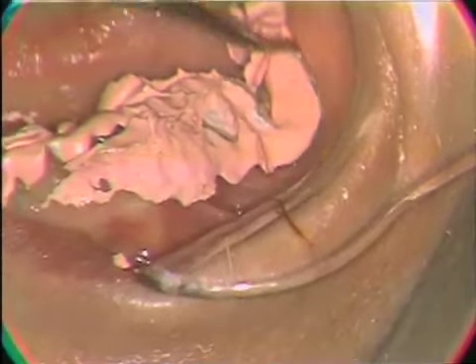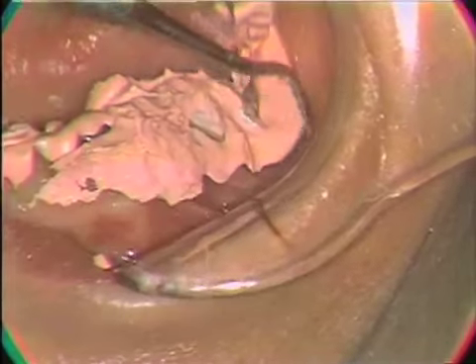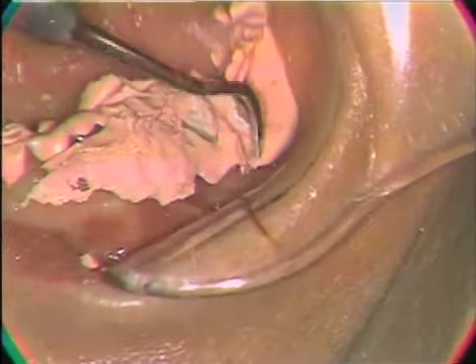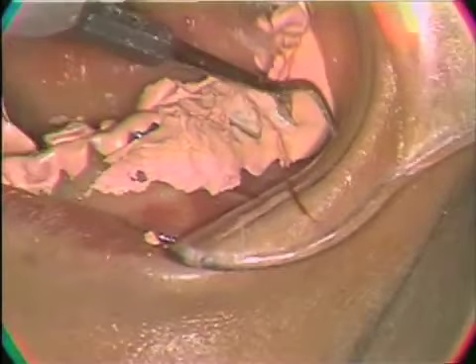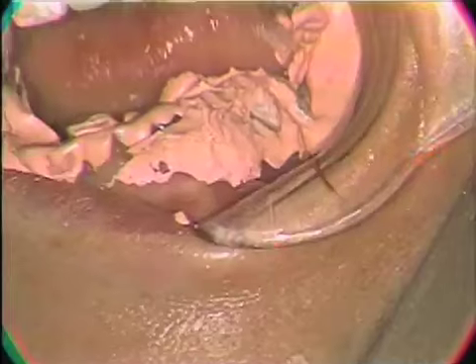If it looks like you have a void in that area, it is well to go ahead and add a little mix of the material right at this time. So you can correct the peripheries if you want to before you take the impression out of the mouth. So examine the peripheral areas that you can see. It looks like we've got a good roll on that area.